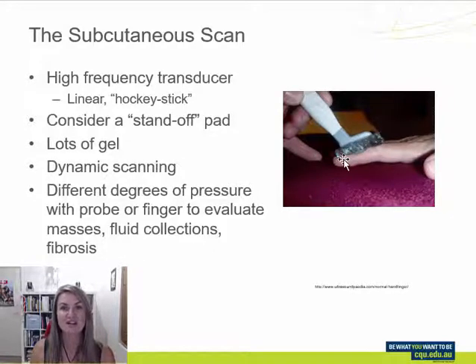We can see here, just like we did on the eye, how much gel we need to use so that we're covering all of those bony structures. And because we're looking at skin in some areas, like particularly fingers, where we've got lots of little dimples and folds in the skin, that's all got to be filled up, a bit like polyfiller, filling it all up so that we've got that nice smooth area that we're going to be scanning.